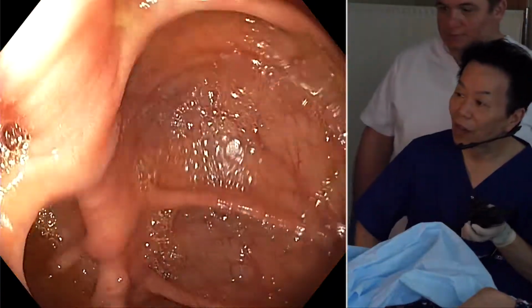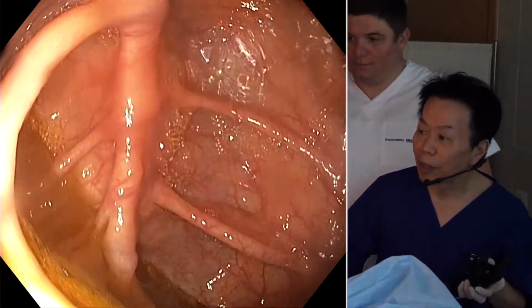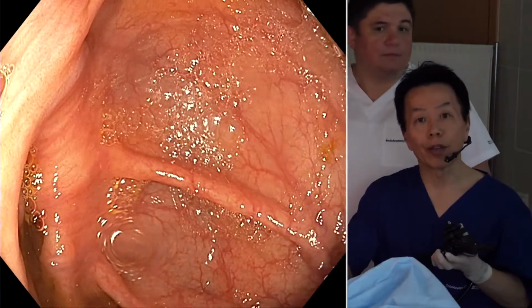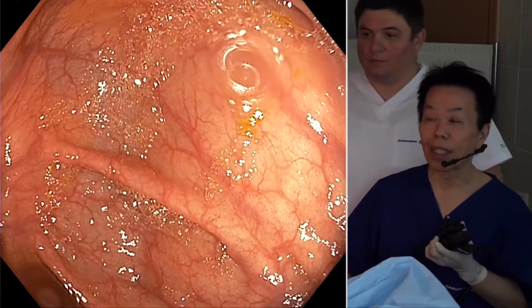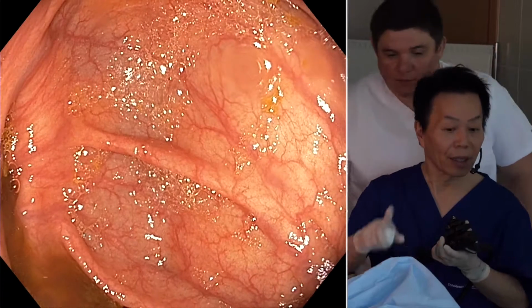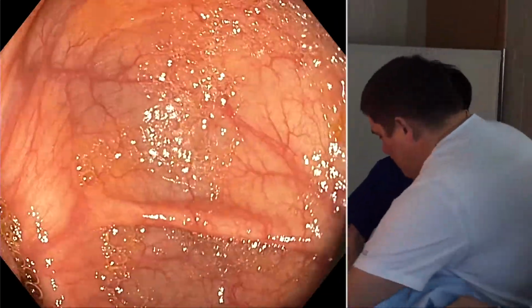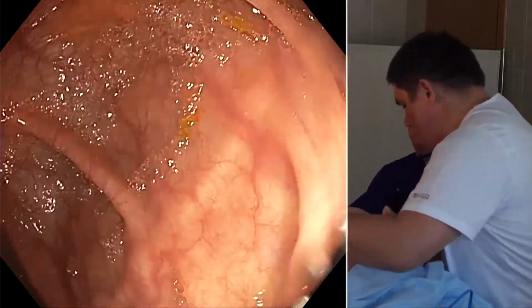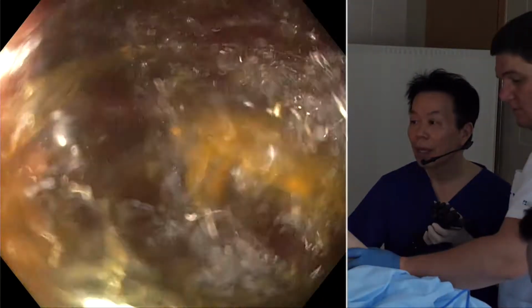So this is the ileocecal valve, but it might be a little bit difficult to enter into the terminal ileum. So in Japan, we usually change the position of the patient to the supine after reaching the cecum. So can I change again to the supine, on her back? During the observation, we usually have the patient on his or her back. Yeah. Good enough for you? Maybe it's good. And sometimes I try on the right side too.